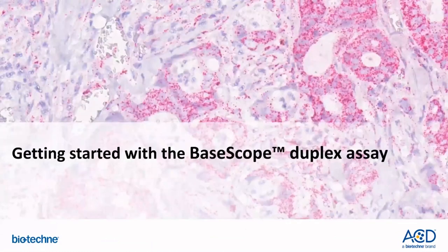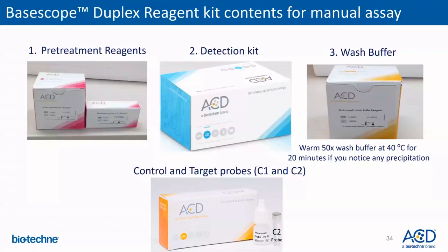Here is some information about getting started with the BaseScope Duplex assay. The BaseScope Duplex Reagent Kit contains pre-treatment reagent, detection kit, wash buffer, and target probes. Control and target probes are C1 and C2 probes. Usually the C2 probes are provided in 50x concentrates.